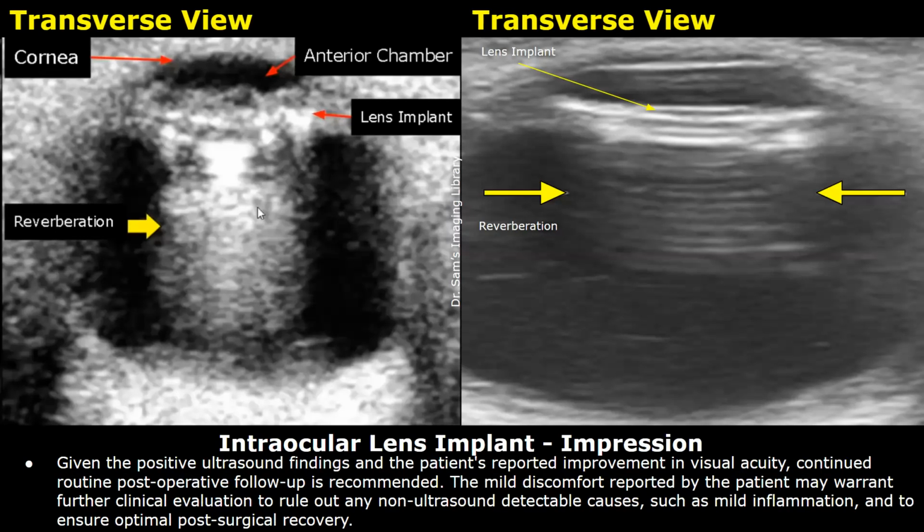This is a continuation of the impression. Given the positive ultrasound findings and the patient's reported improvement in visual acuity, continued routine post-operative follow-up is recommended. The mild discomfort reported by the patient may warrant further clinical evaluation to rule out any non-ultrasound detectable causes, such as mild inflammation, and to ensure optimal post-surgical recovery.